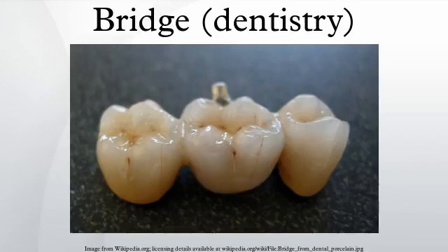Sometimes, the bridge does not seat, but the dentist is unsure whether or not it is only because the spatial relationship of the two or more abutments is incorrect, or whether the abutments do not actually fit the preparations. The only way to determine this is to section the bridge and try on each abutment by itself. If they all fit individually, it must have simply been that the spatial relationship was incorrect, and the abutment that was sectioned from the pontic must now be reattached to the pontic according to the newly confirmed spatial relationship.